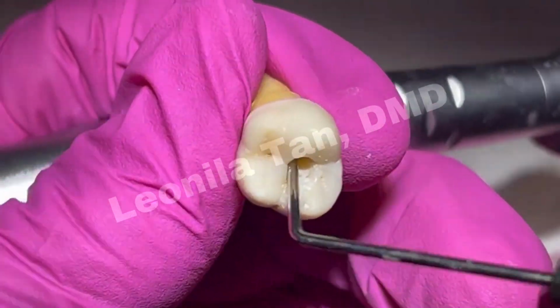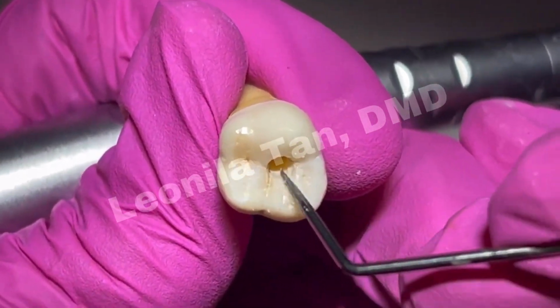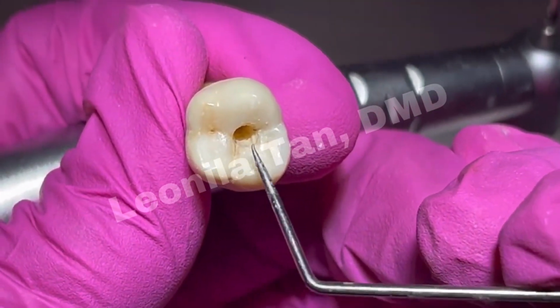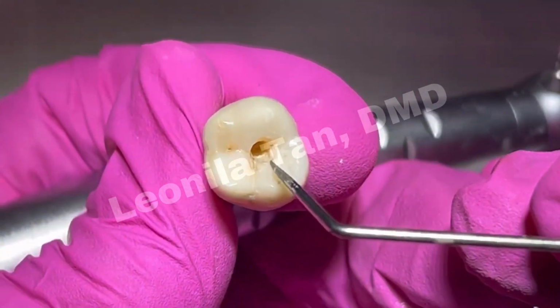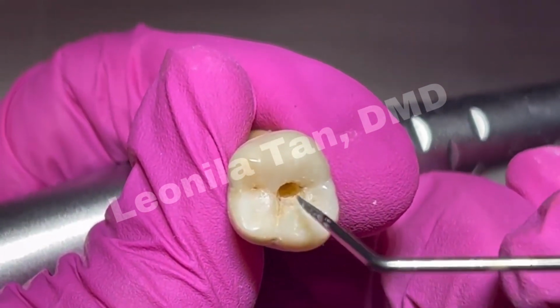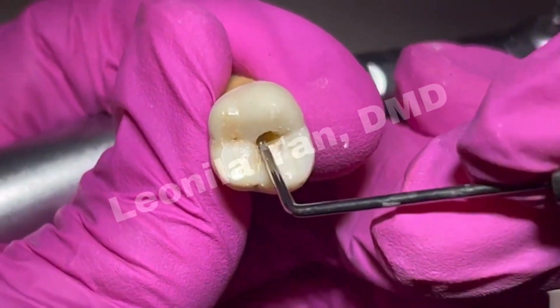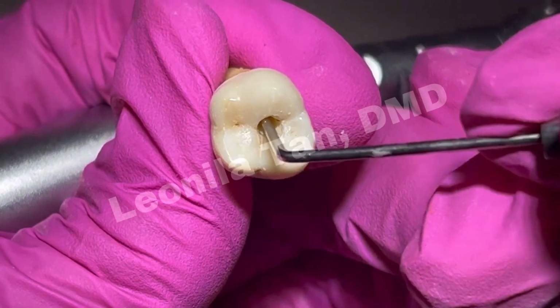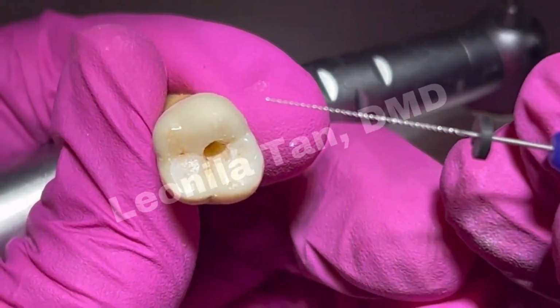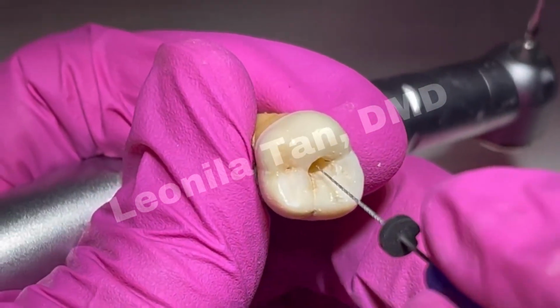It tells you that you are in the right direction, or if you have slight adjustments to be made. If the roof of your chamber is already very thin as you enter, sometimes your probe is able to go in. Like here, the file at my estimated working length based on the radiograph is able to enter.